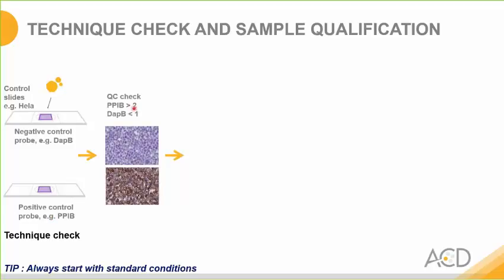that we just described. In the first step, slides prepared from cell lines can be tested with the appropriate positive and negative controls. In this case, DAP-B for the negative and PPIB for the positive. If the PPIB signal is greater than 2 dots per cell, as indicated here in the lower panel where you can see the brown chromogenic signal, and the DAP-B signal similarly shows less than 1 dot per cell, so you can see in the upper panel here, tissue essentially has no brown staining.